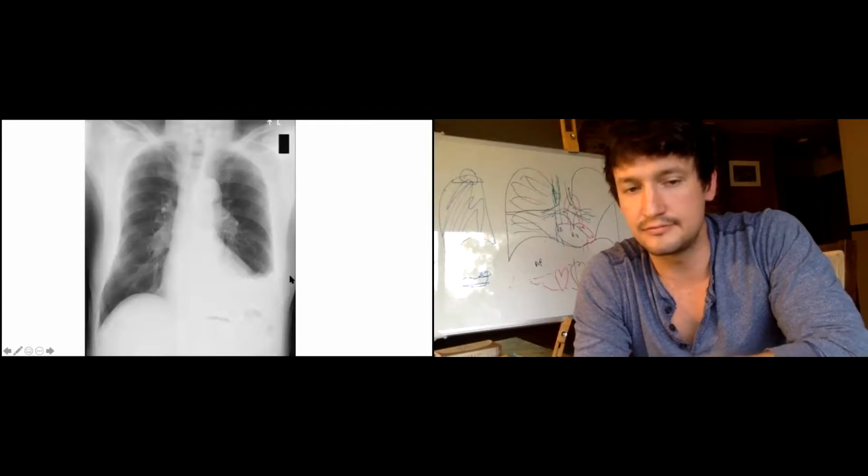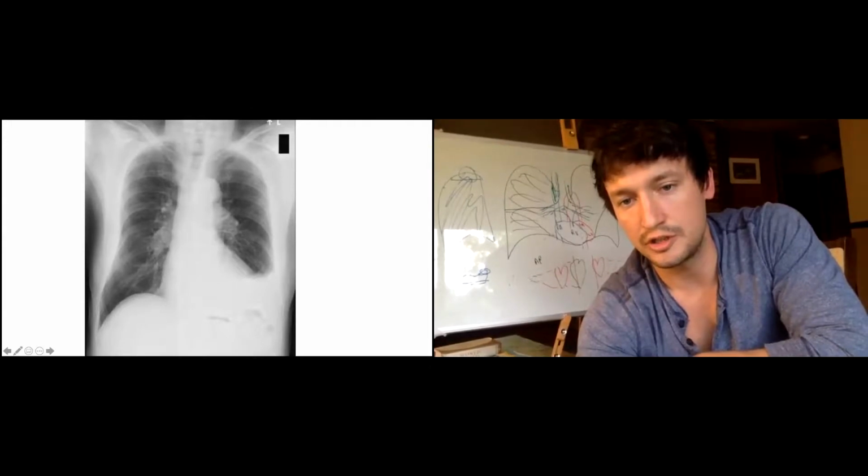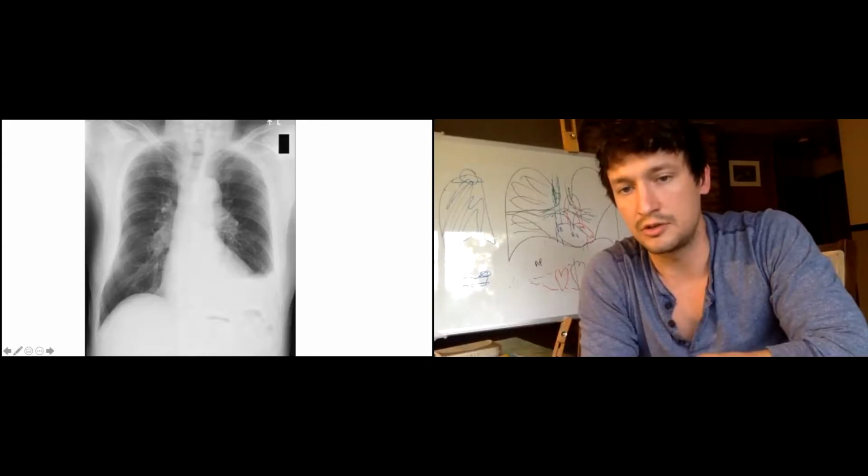I know you guys all know this, but I had to show you a pleural effusion. This is just a left pleural effusion. You can see the costophrenic angle is totally obliterated, and you can see this little meniscal lip coming up here. This is called the meniscus sign. It looks like what you'd expect if there was water in between the lung and pleura. Next slide.